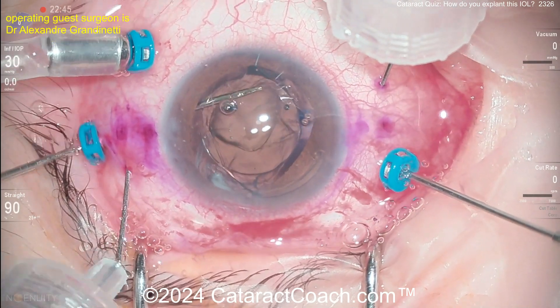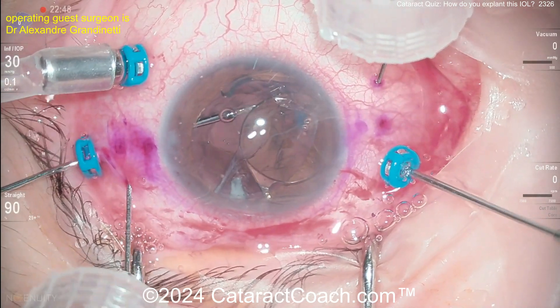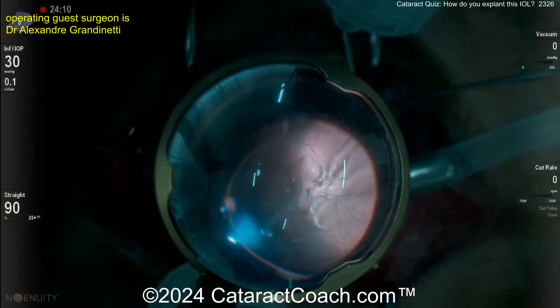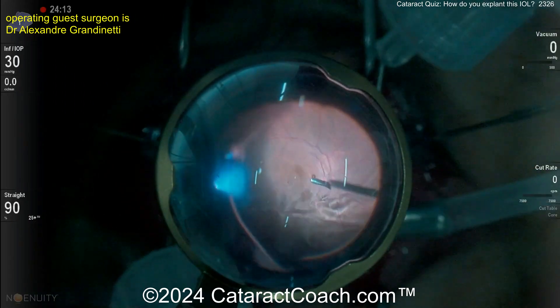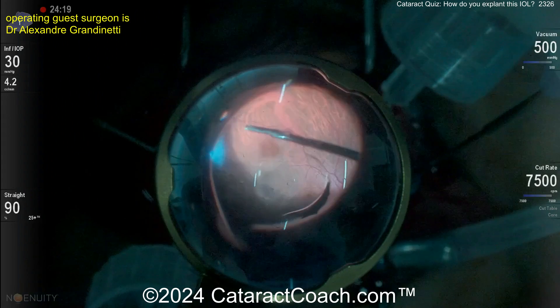The surgeon here is going to do something very smart: why not make a scleral tunnel and take this lens out through that instead? Making a beautiful scleral tunnel is a bit of a lost art, and it's something that all cataract coach fans should really be able to do very well.